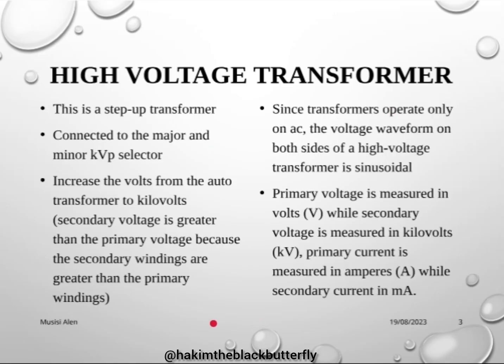So the transformer works on only AC voltage. For example, if this is the primary side and this is the secondary side, the voltage in the primary is sinusoidal, though with a lower amplitude, and the voltage in the secondary is sinusoidal, though with a higher amplitude, if it is a step-up transformer.